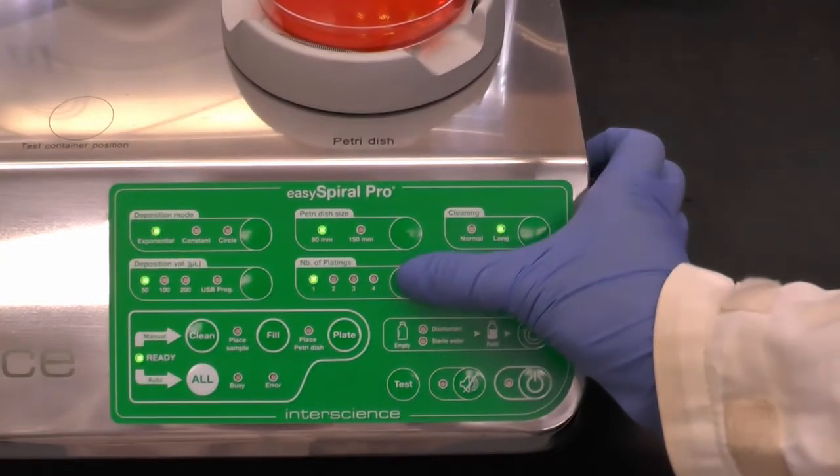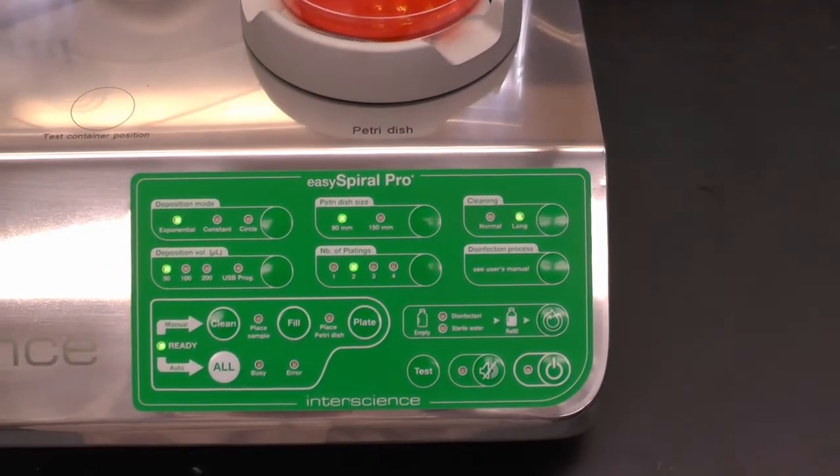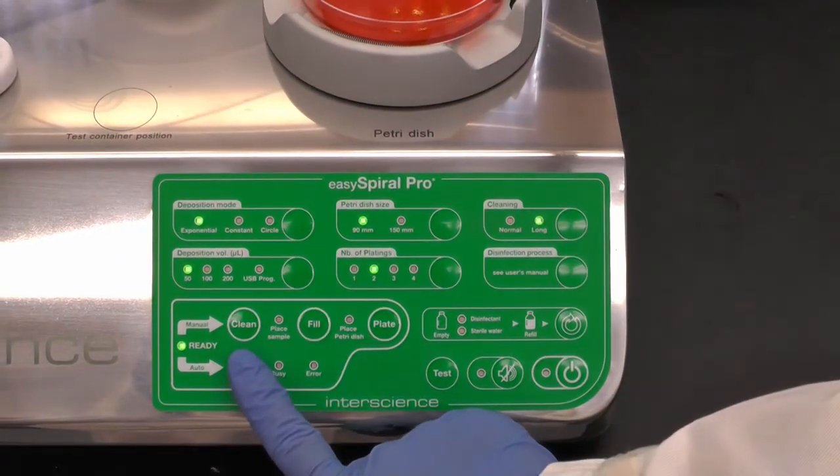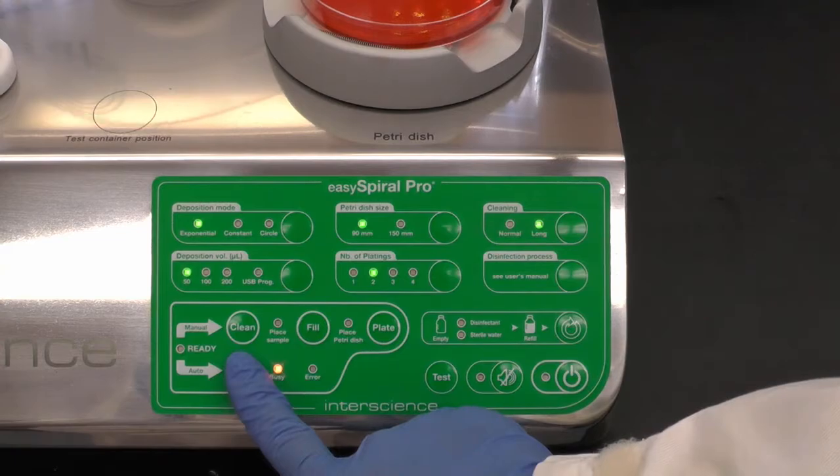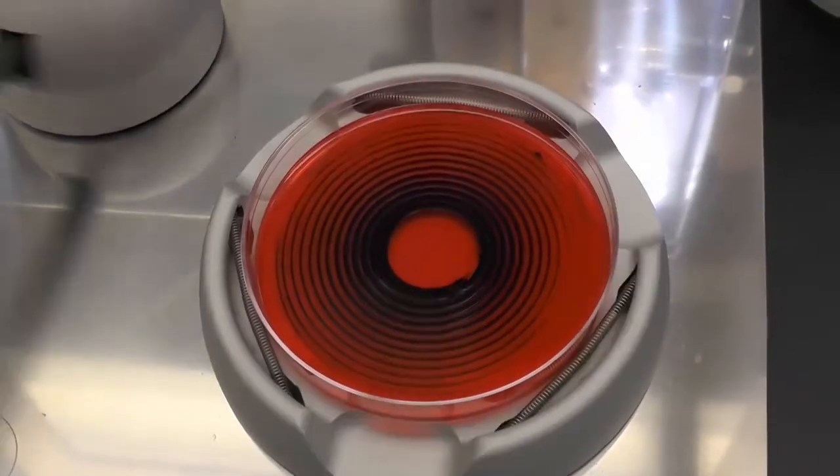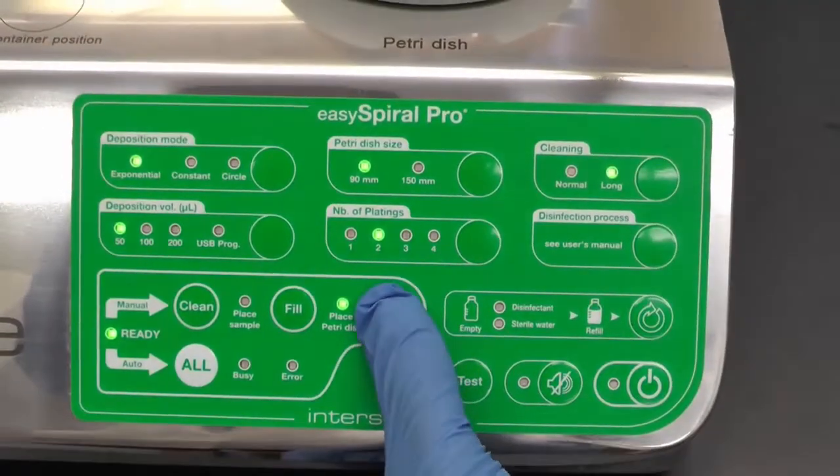If you want to plate multiple plates with the same sample in a row, you can set the number of plates option to two, three, or four on the control panel. With your sample and plate loaded, press all. After the first plating is complete, replace the first plate with a new agar plate and press the plate button. This setting can shorten the time needed for each plating.